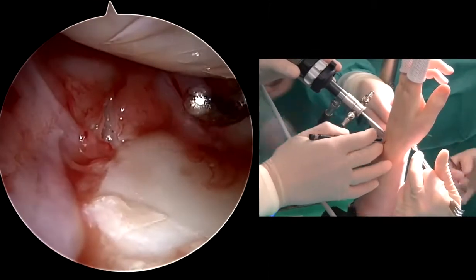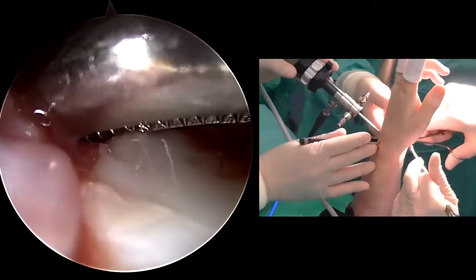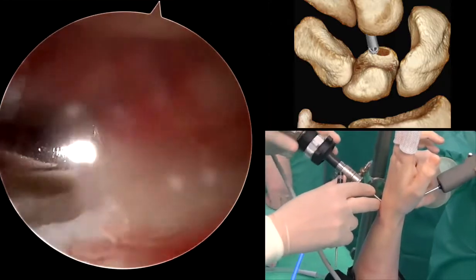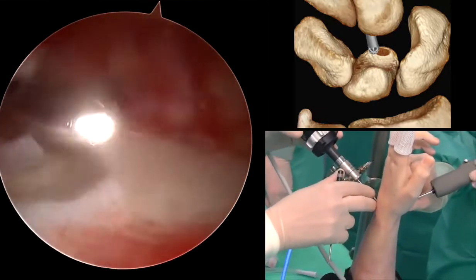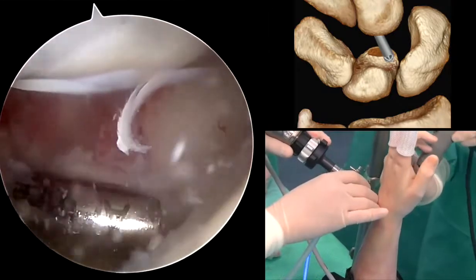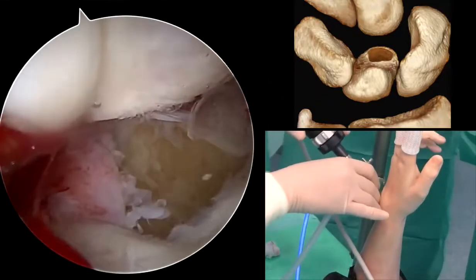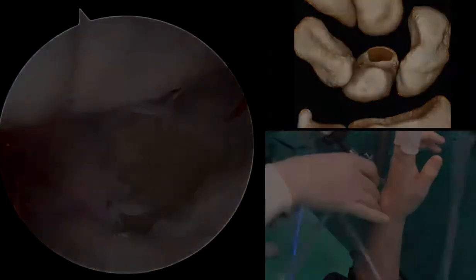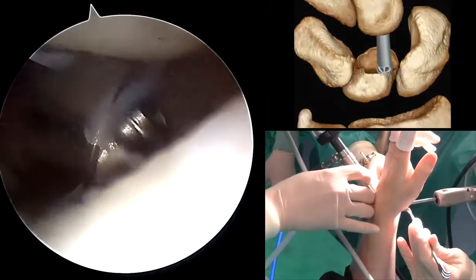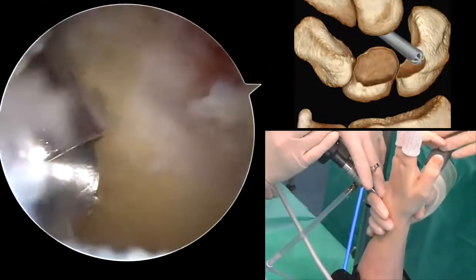This portal is made under arthroscopic control with the arthroscope located in the ulnar midcarpal portal. Next, the resection of the bones begins by removing the volar portion of the lunate. This step is performed initially with a 3 mm burr entering through the volar central midcarpal portal and looking from dorsal. Once the volar space is increased, a 4 mm burr can be used to remove faster the volar portion of the lunate.